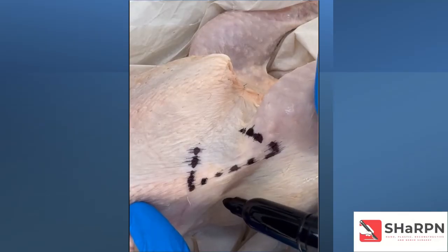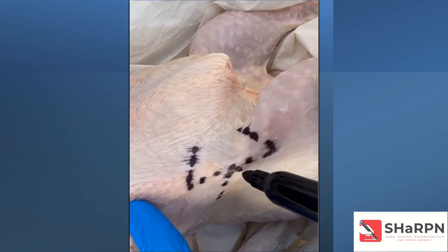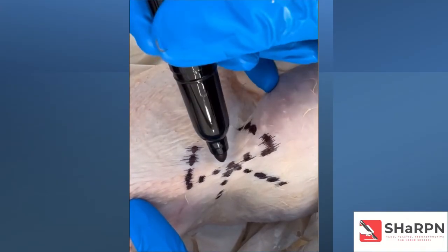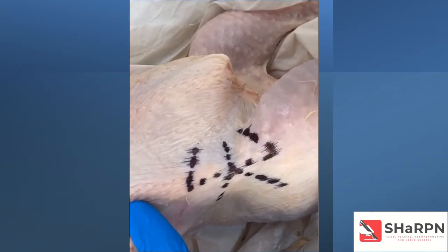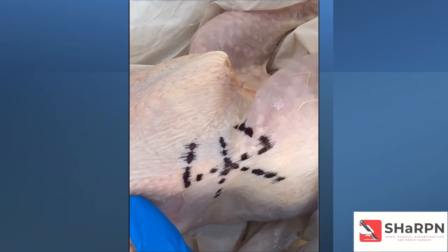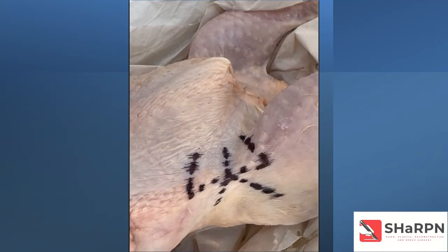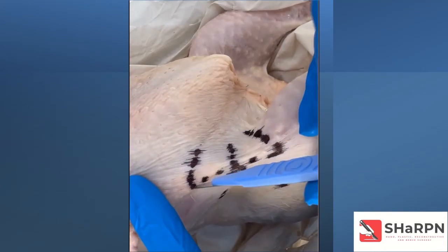When designing the triangular flap or the C flap, this triangular flap is going to advance into the web space, and I usually design this on the dorsum of the hand as the skin here is more mobile. The actual cut that you make to advance the triangular flap into, I make at the end because, again, you don't want to compromise the base of your other flaps, and you might not need to use the entire length of that split, which I'll demonstrate now.